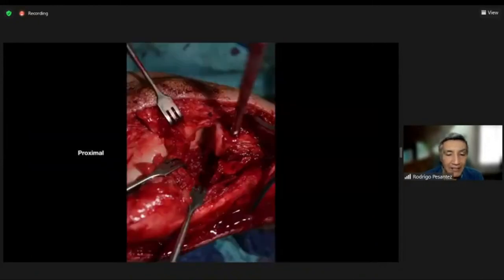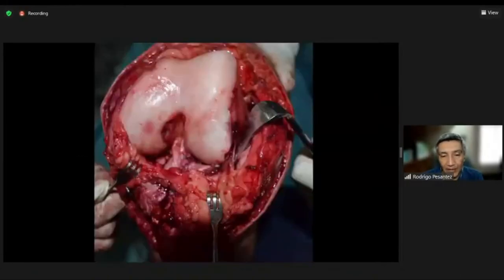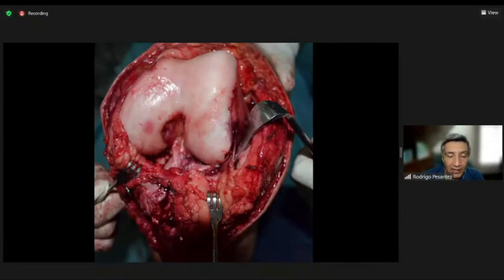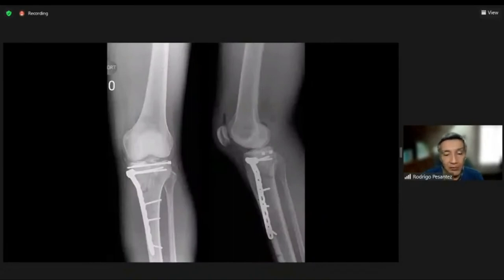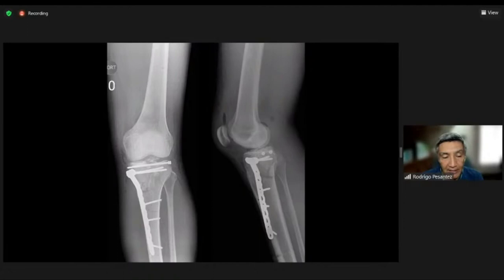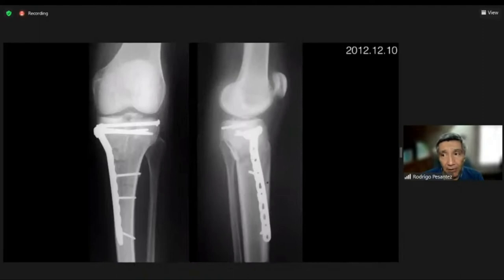Small retractors held the ACL in position. Using bone tunnels, we repaired the ACL and reduced the spines. The immediate postoperative X-rays show a medial plate with rafting screws from the lateral side — these two rafting screws positioned posteriorly to hold the central posterolateral impaction. The tibial spines were secured with sutures.